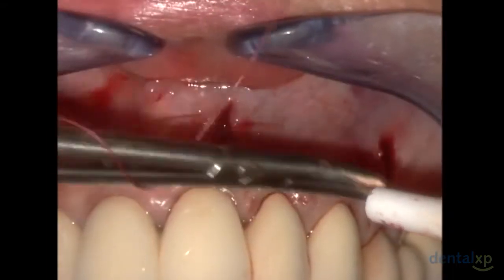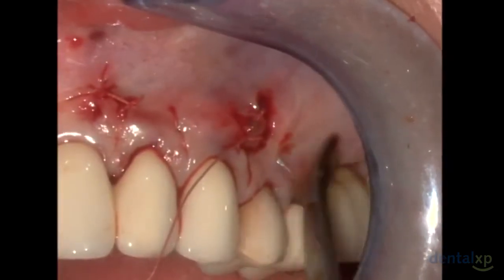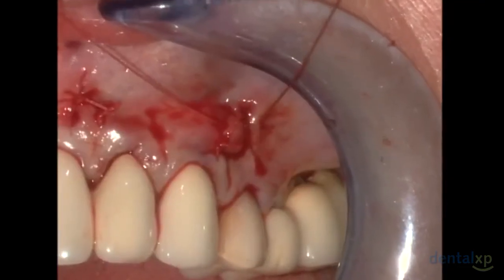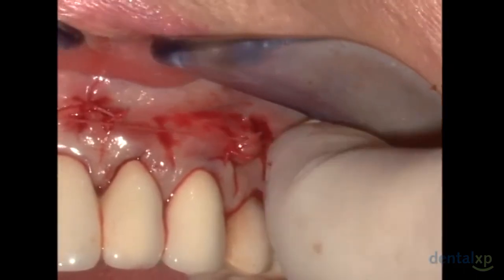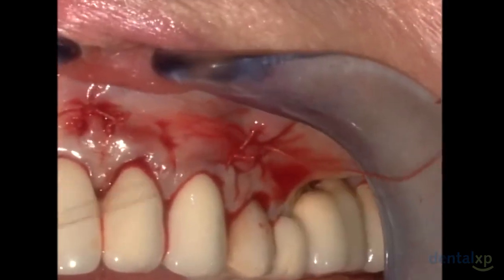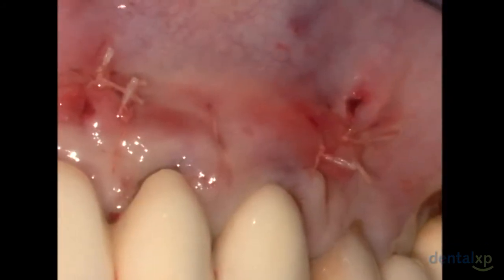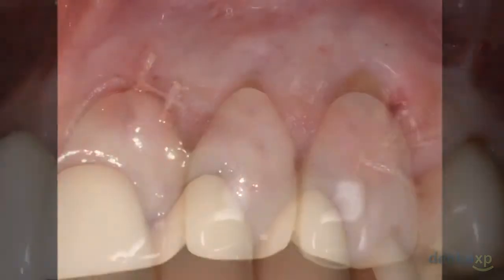In this case this is Vicryl, as the patient lived out of town. A horizontal crisscross mattress suture is utilized to approximate the vertical incisions in the VISTA technique. And I've been very fond of utilizing this technique, utilizing the Duell VISTA instrumentation that was created by Dr. Zadeh. So here you can see approximately 4 sutures were utilized, 2 vertical incisions, and utilizing these VISTA instruments allowed us to coronally advance the flap over the recession defects and add thickness of tissue utilizing the Perioderm.